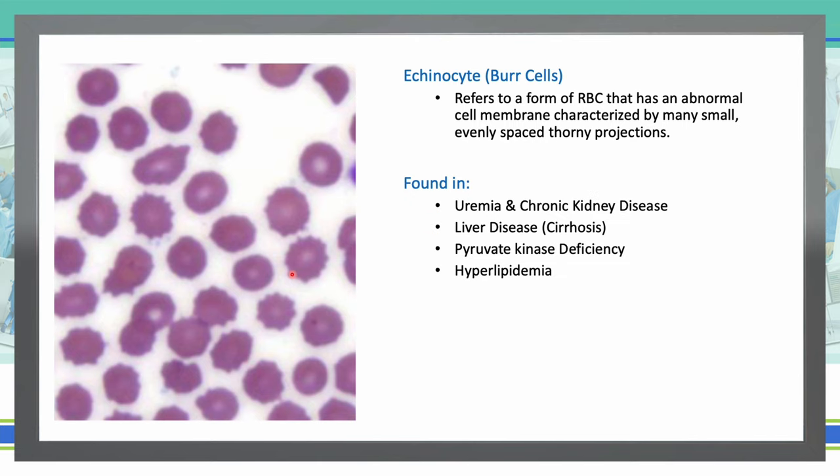We are going to see burr cells in uremia and chronic kidney disease, liver disease such as cirrhosis, pyruvate kinase deficiency, and in hyperlipidemia.